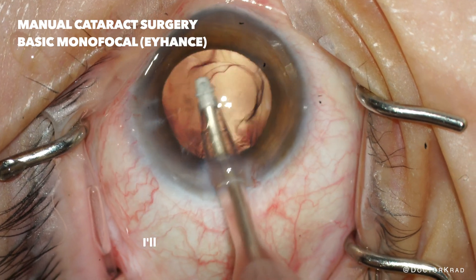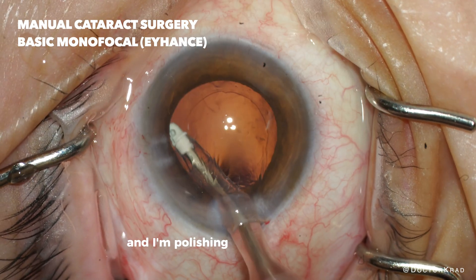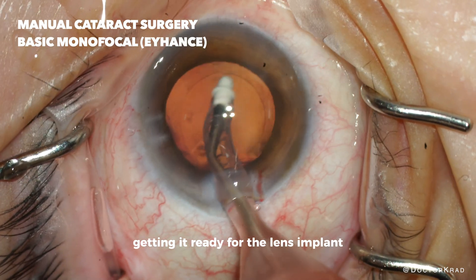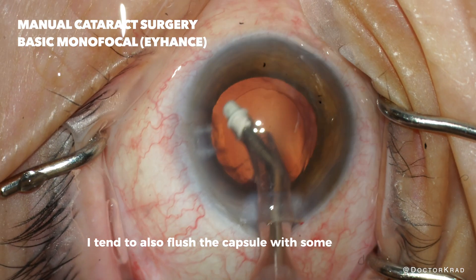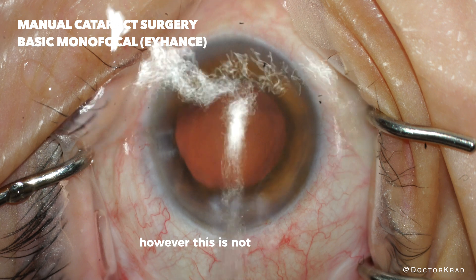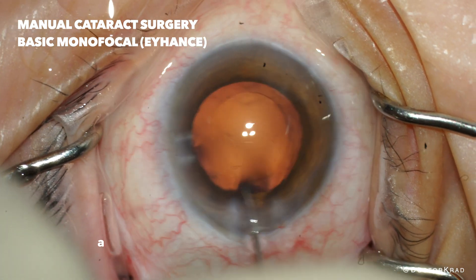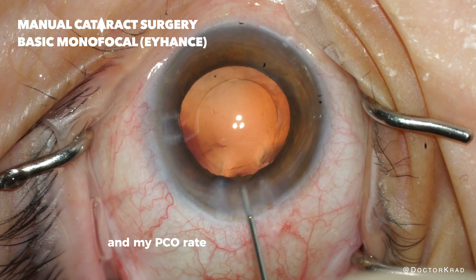Now that it's all gone I'll just do a little bit of polishing. I switch to polish mode and I'm polishing the anterior capsule and the posterior capsule as well, getting it ready for the lens implant. I also flush the capsule with some balanced salt solution after I polish with the IA handpiece. This is not a recent video because my technique has changed — I now make sure to dump an entire 3cc syringe of BSS onto the posterior capsule, and my PCO rate has decreased significantly.